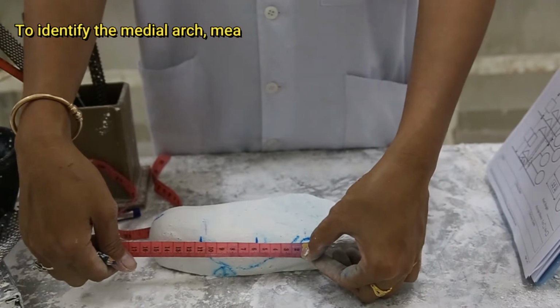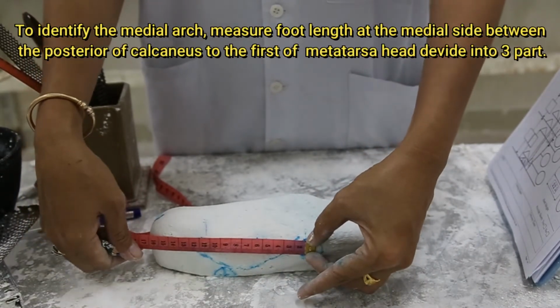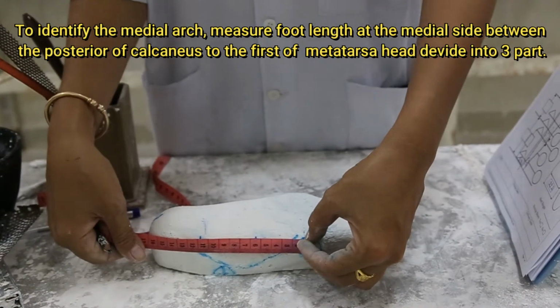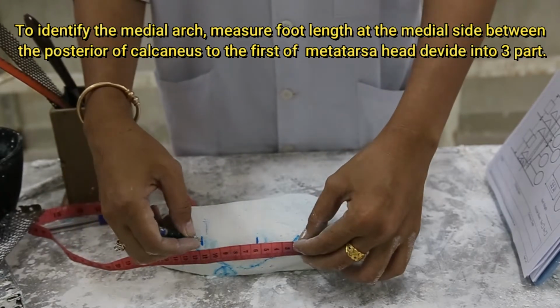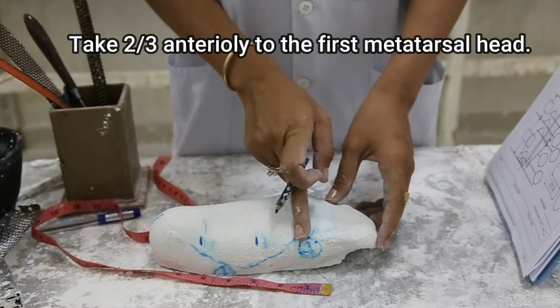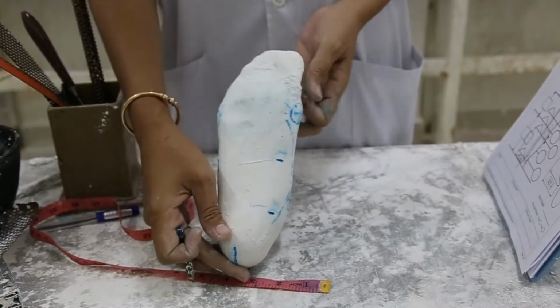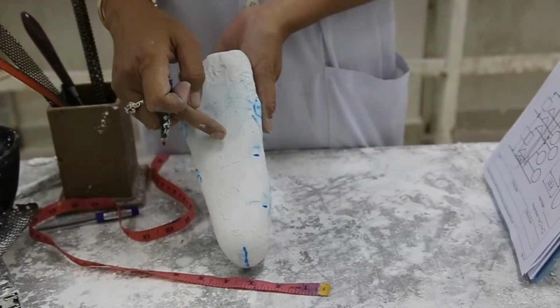We take the measurement from the first metatarsal head to the posterior of the calcaneus, and then we are going to divide by 3. After we divide by 3, we just take 2/3 and really that is the medial arch. And then the other one, we are going to identify where the medial arch is located.